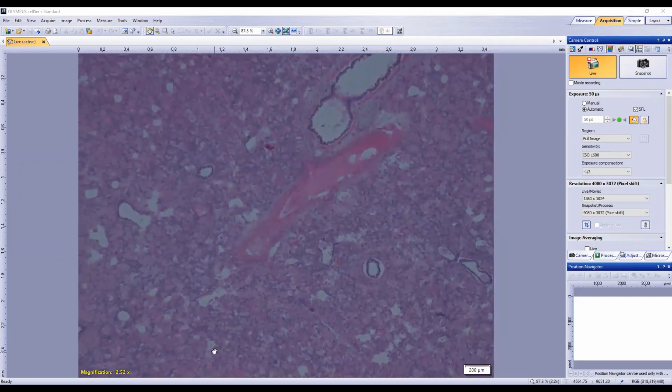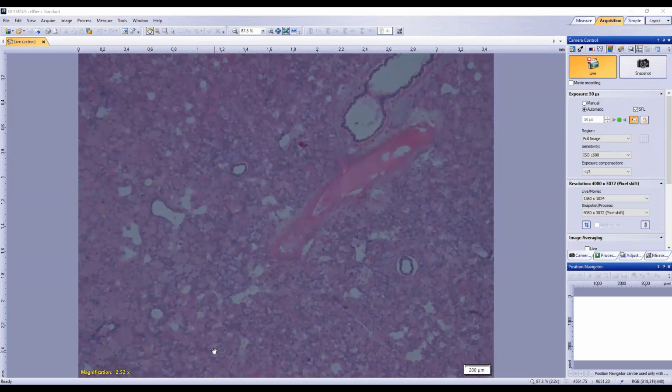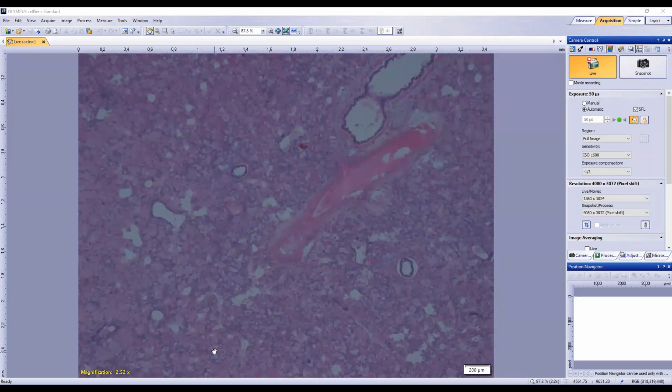So is there type 2 pneumocyte hyperplasia? Yep. What's our process behind that? It's a compensatory process. Yeah. Basically. Yep. Because if your type 1 pneumocytes are damaged, then type 2 pneumocytes have to fill up the epithelium so that it doesn't leak anymore. Yep. So, exactly. And so epithelium in general is a covering and lining cell, so it's going to try and repair the defect as best it can.